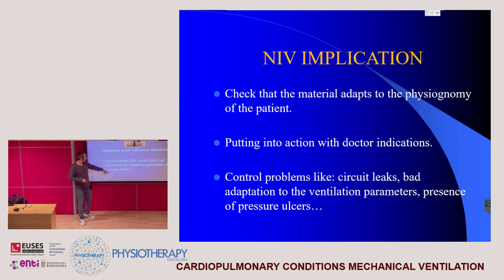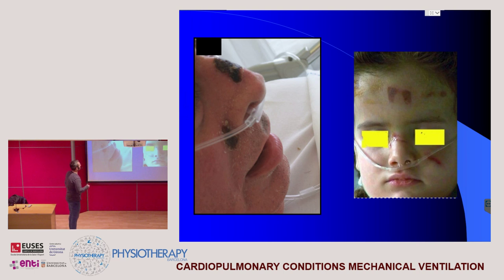And finally, the presence of pressure ulcers. As I said, those masks have to be attached tightly, so some injuries could appear that will provoke other problems, like the ventilation cannot be performed for several hours, for example.